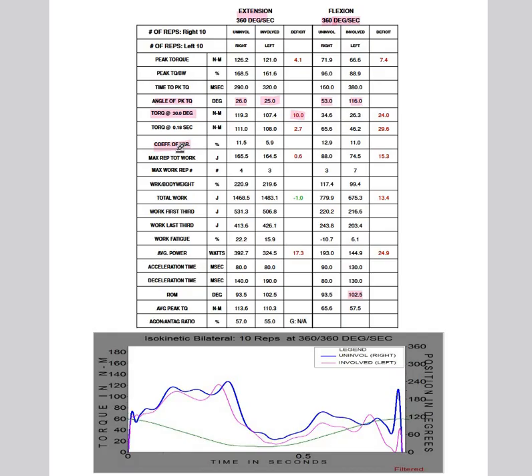So really, the lower the value you get here, the better. This is the reason we have a familiarization session, because someone who's never performed this test before will have a much higher coefficient of variance. These values are actually pretty good, really. Ideally you would want them to be in single digits, but they're not far off. So this suggests that each repetition was performed consistently.